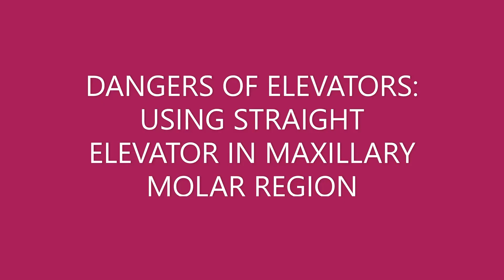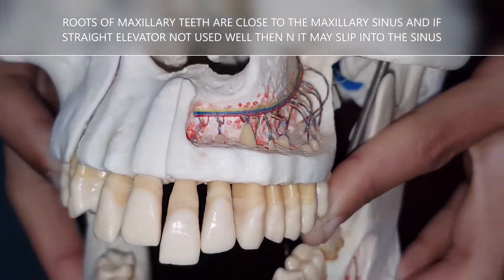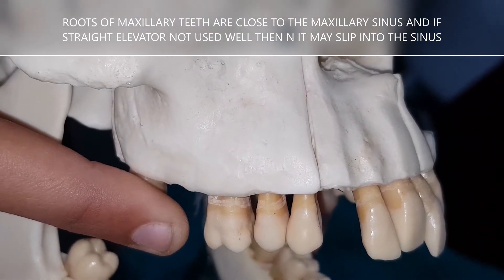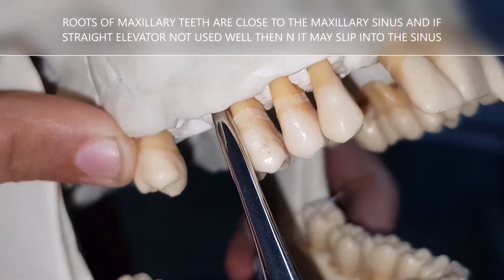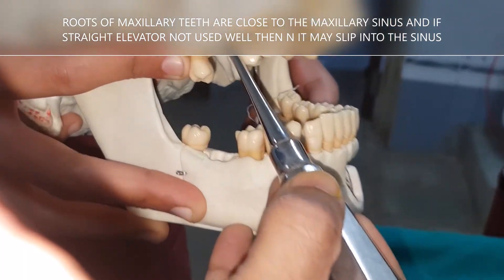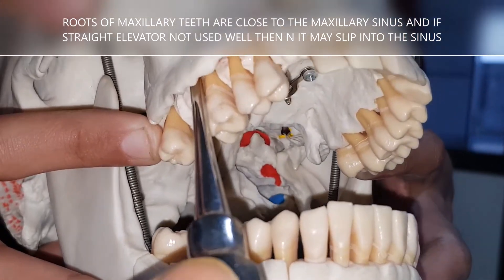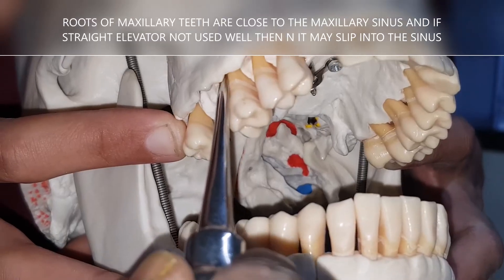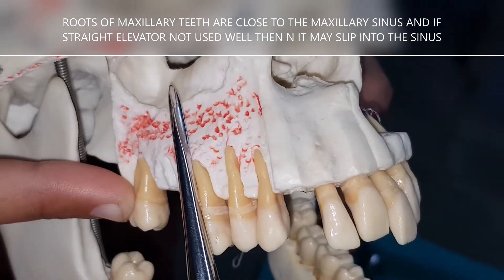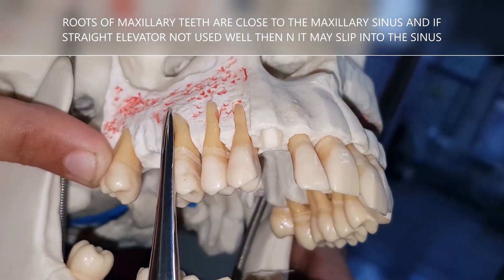Another danger: using the straight elevator in the maxillary molar region. In the maxillary molar region, the roots are close to the sinus. If you hold the elevator parallel to the tooth and generate force, the tooth may get luxated and your elevator may suddenly slip into the sinus — with or without the tooth or root pieces. The sinus is just above the roots of the first or second molar.